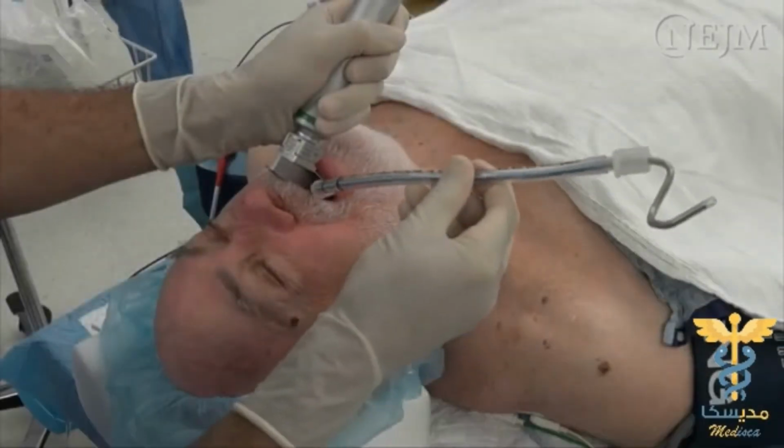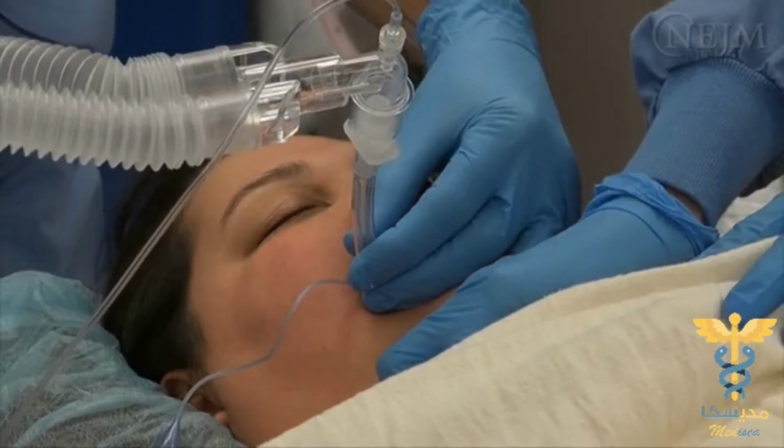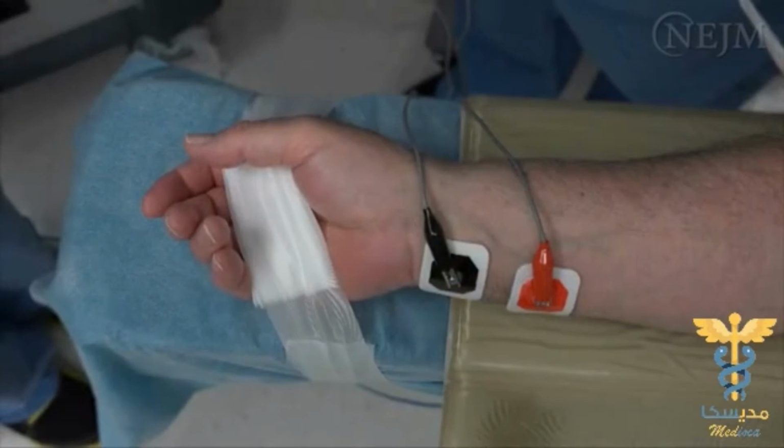Neuromuscular blocking agents make a variety of life-saving procedures possible. However, these agents can be lethal unless appropriate ventilation is provided, and the use of a peripheral nerve stimulator at a minimum, or a monitor whenever possible, to guide administration of blocking agents is recommended.